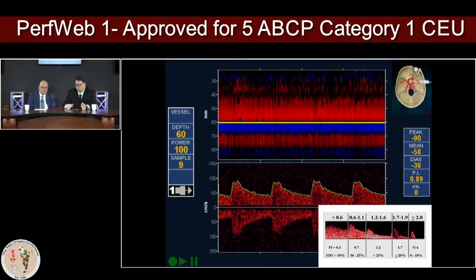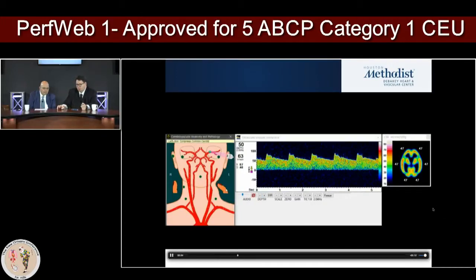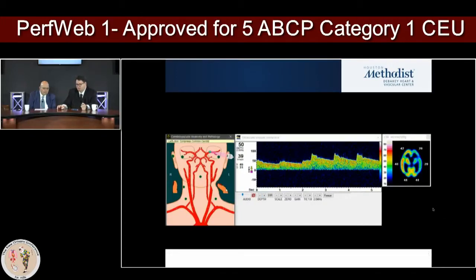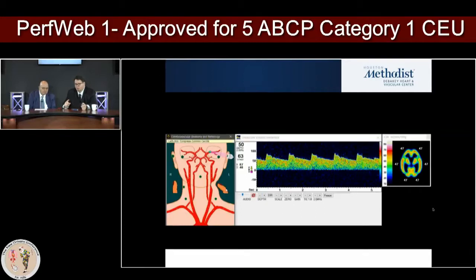Quickly, I just want to show you, how do you see this blood flow change? Watch, I'm just going to put my fingers on the carotid. This is how the flow changes immediately. With an EEG, you're waiting 2 minutes to see some changes. Here, the flow changes are immediate, in milliseconds. So this is the normal flow pattern, and when I put the finger on the carotid, it immediately shows you there's a blockage.